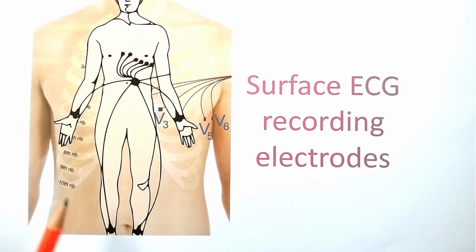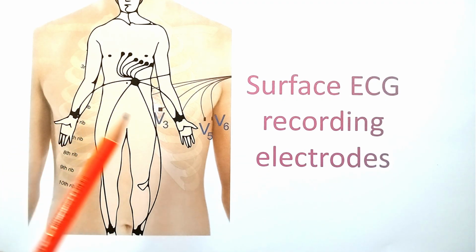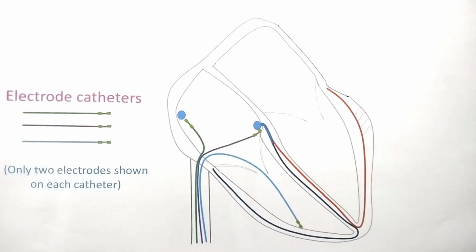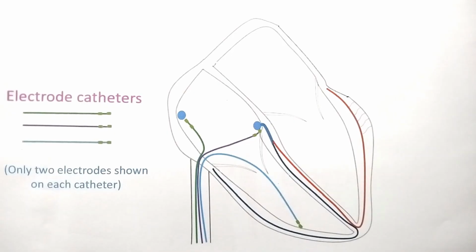That will have different combinations of the electrodes. Electrodes are not leads. When 2 electrodes are connected together in the machine and the recording taken, that becomes a lead.